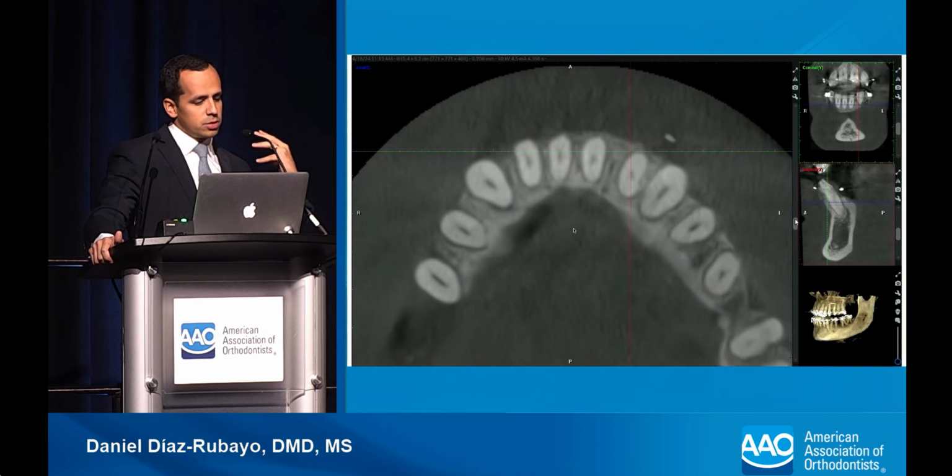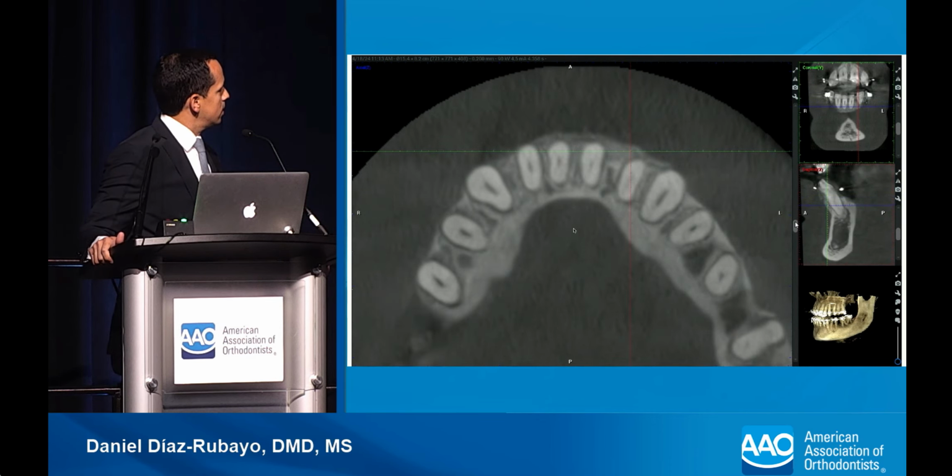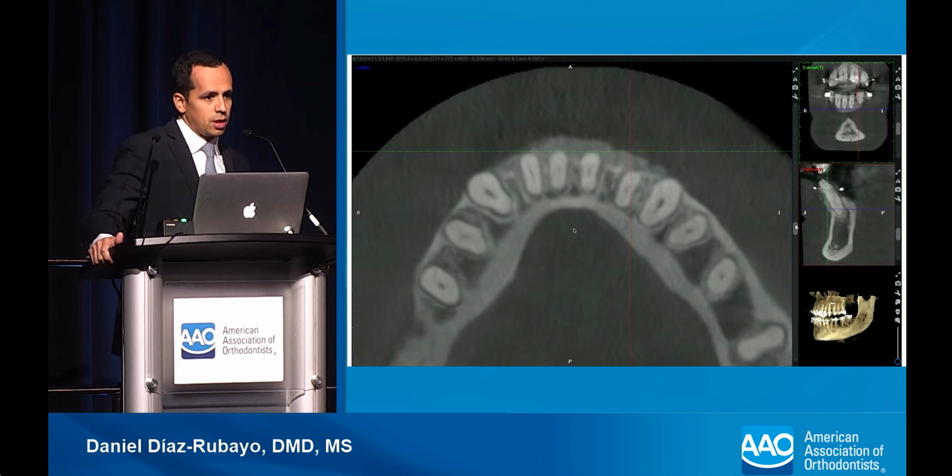I love how she puts so much bone in there. This is about 5 months after the graft was placed.